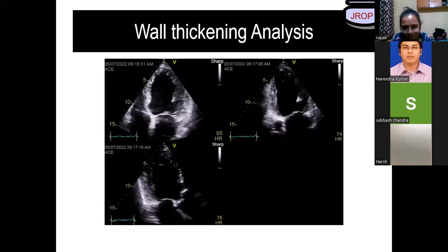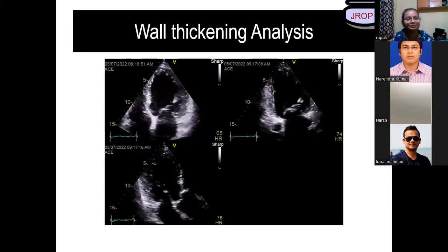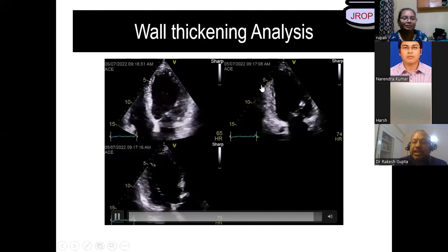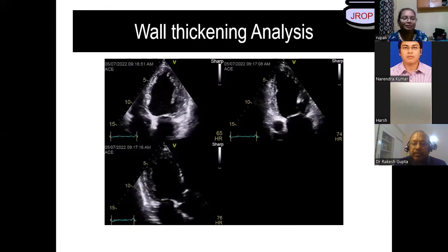We'll come back again. Let's go to Dr. Veerwar Jha. Yes, sir. Dr. Veerwar, are you there? Yes, sir. Present, sir. Veerwar, tell me about this second segment. This is, sir, apical two-chamber view. Be sure what you're saying is right.